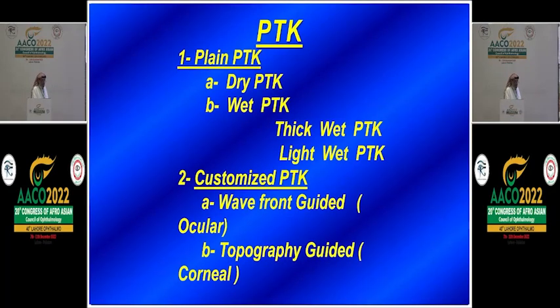Therapeutic PTK. PTK is divided into plain PTK or customized PTK. Plain PTK is either dry PTK or wet PTK, and then there is thick wet PTK and light wet PTK, but this is not the issue for today. Today we are discussing customized PTK. Are we going to go for wavefront guided or topography guided PTK?